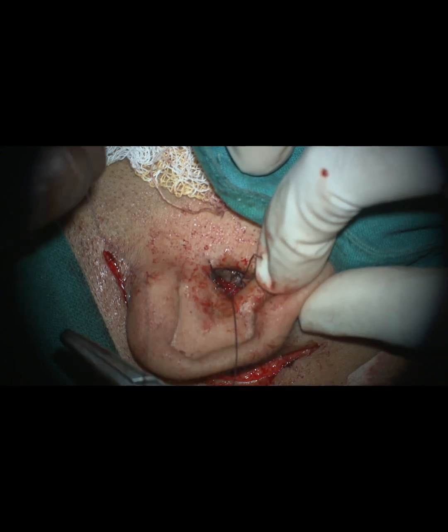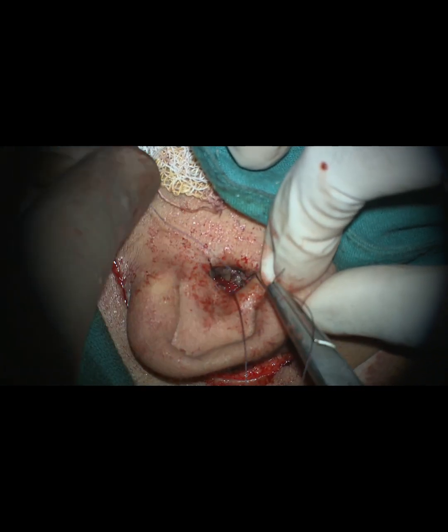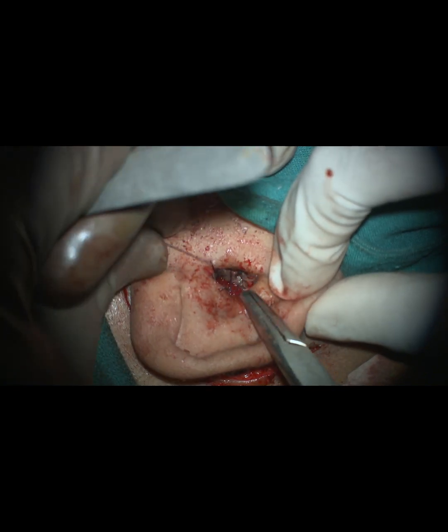After all around suturing, medicated umbilical tape was placed within the canal, which was removed after 10 days.